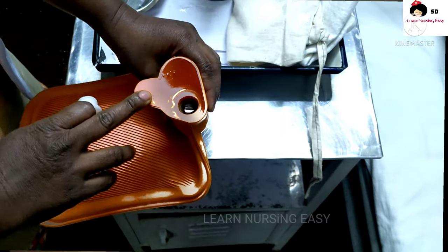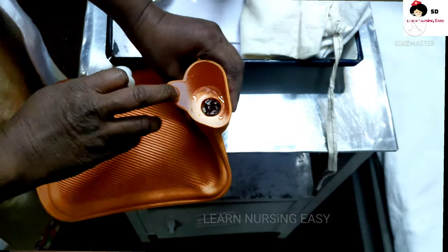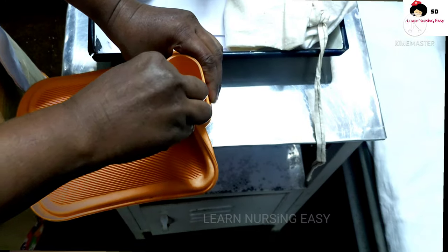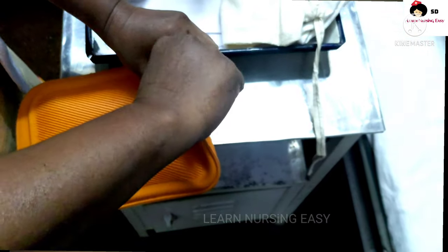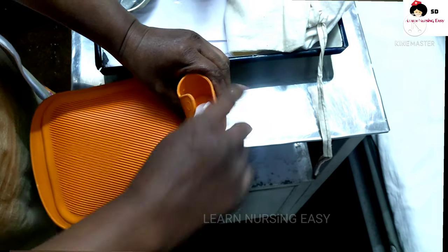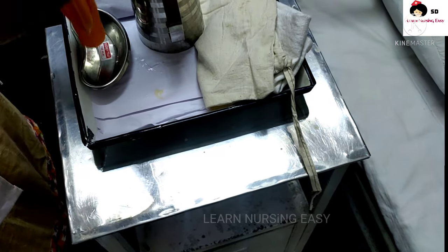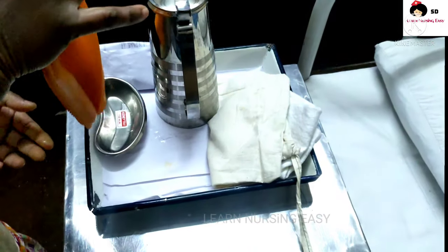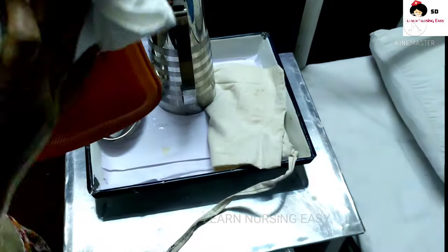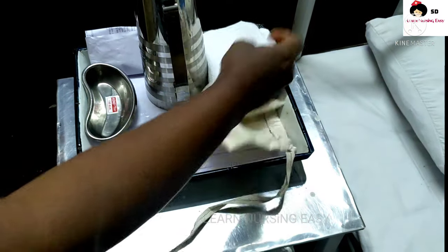Fill only three-fourths of the bag. While closing the bag, keep it on a flat surface and see that water is coming up to the nozzle opening. Close it with water in the mouth of the bag — this prevents air from entering and cooling the water. After closing, drain excess water into the kidney tray and check the closure of the lid by reversing the hot water bottle to confirm it is tightly closed. If there is any excess water outside, clean it thoroughly so it will not cause burns on the patient.